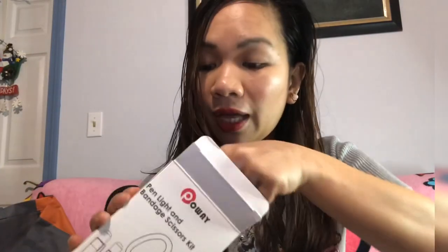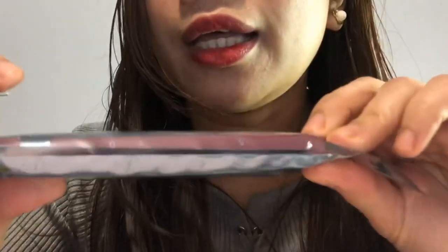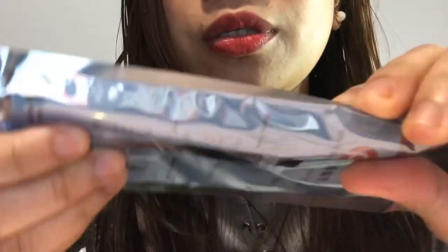Aside from the bandage scissors, it's a bundle, and I also got two pen lights. I haven't opened these yet. It has a pink one and a white one. This pen light has pupil size markings, which will help you a lot — for example, to know the GCS of your patient or how many millimeters the pupil is. They gave me four batteries for the pen lights. The brand is Powe. You can save a lot because it's a bundle.